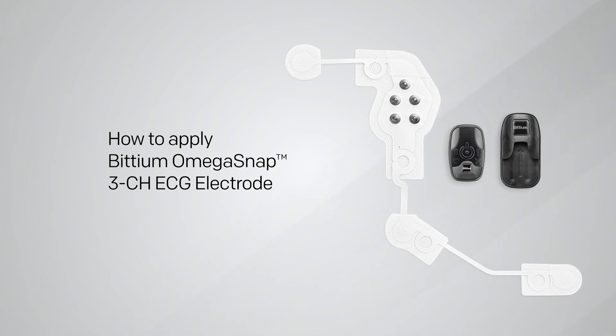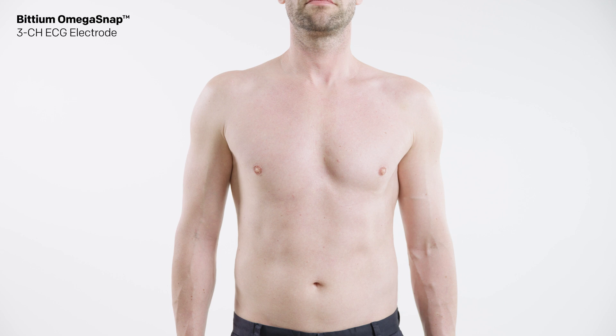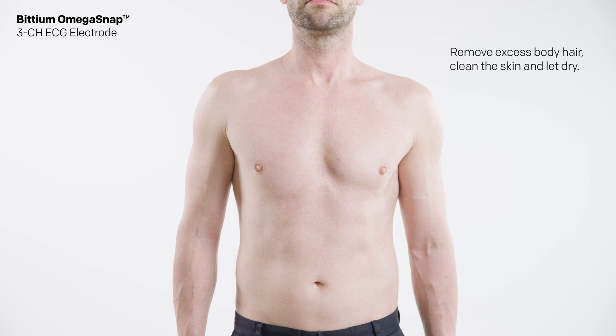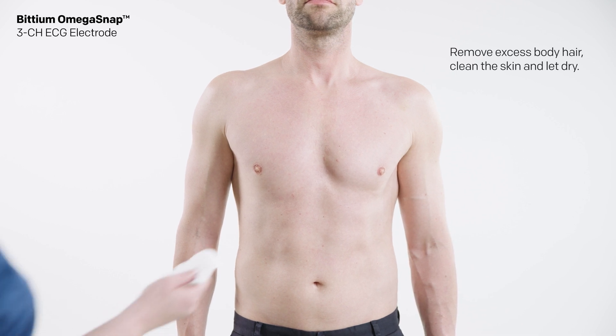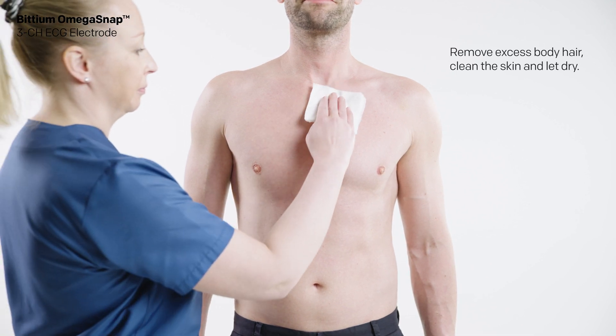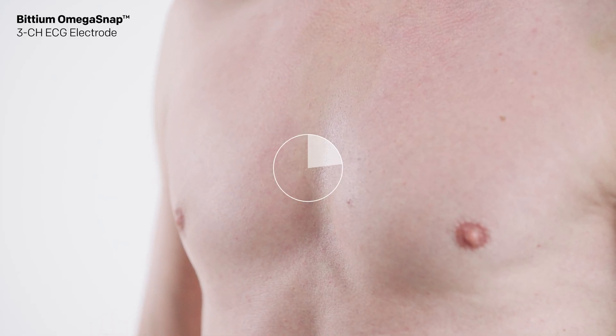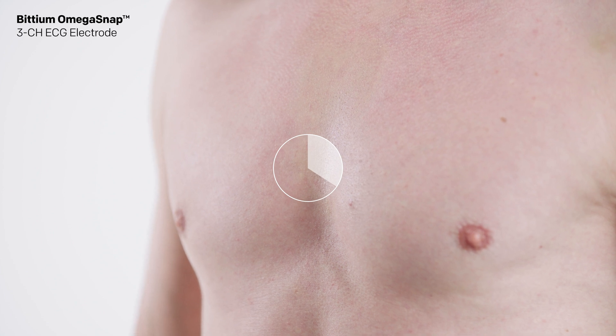How to apply BITTIUM Omega SNAP three-channel ECG electrode. If needed, remove excess body hair using a razor or an electric shaver. Clean the skin according to the instructions given by your clinic or the person responsible for treatment. The skin should be clean and dry when attaching the electrode.